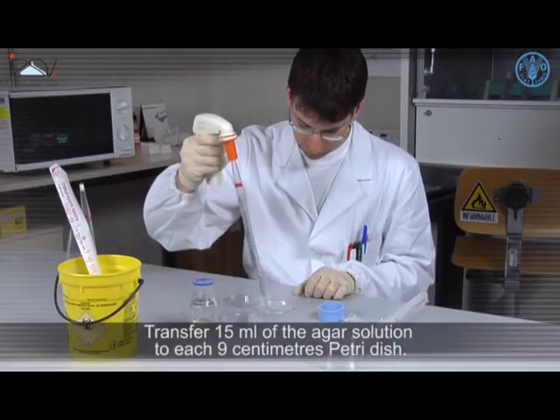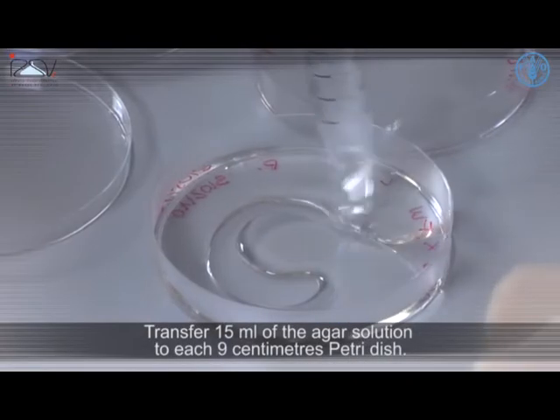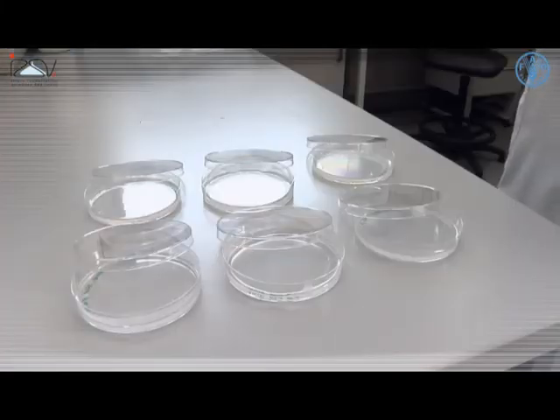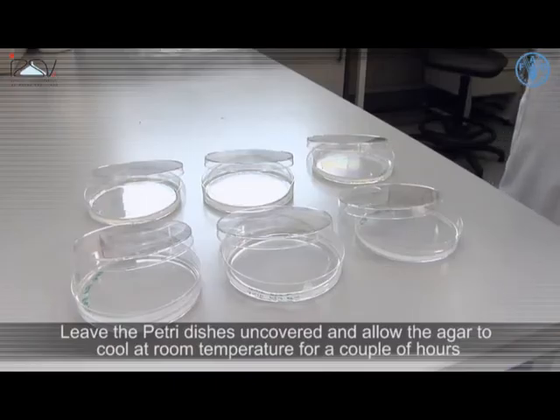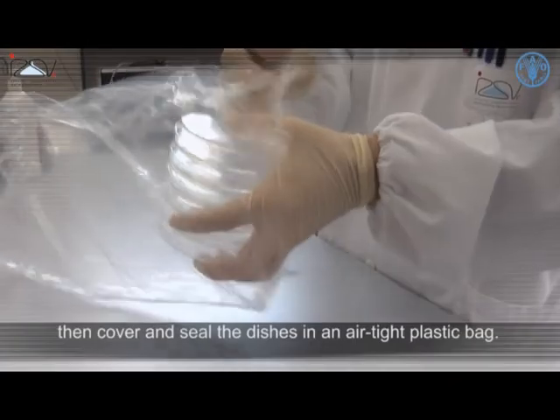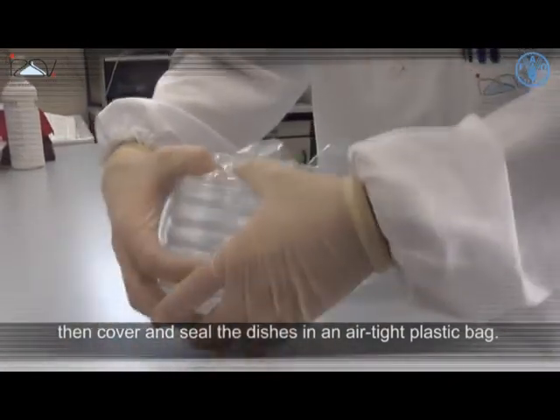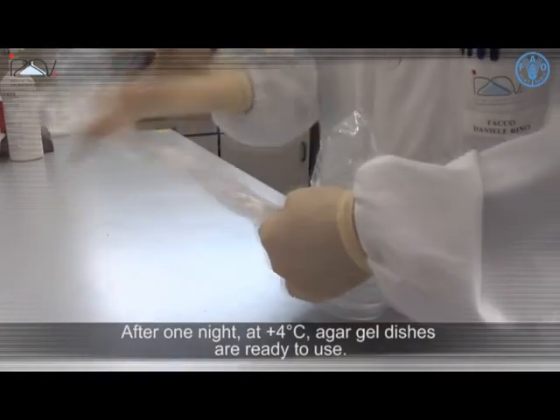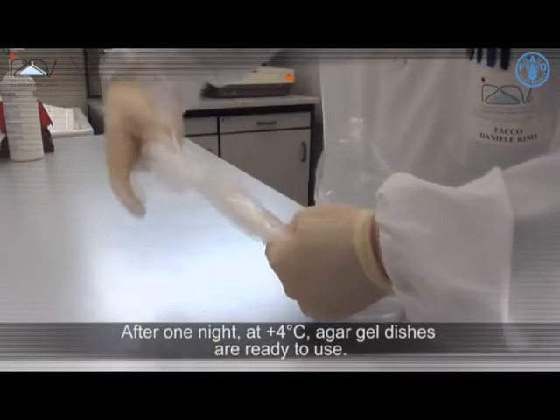Transfer 15ml of the Agar solution to each 9cm Petri dish. Leave the Petri dishes uncovered and allow the Agar to cool at room temperature for a couple of hours, then cover and seal the dishes in an airtight plastic bag. After one night at 4 degrees Celsius, Agar Gel dishes are ready to use.